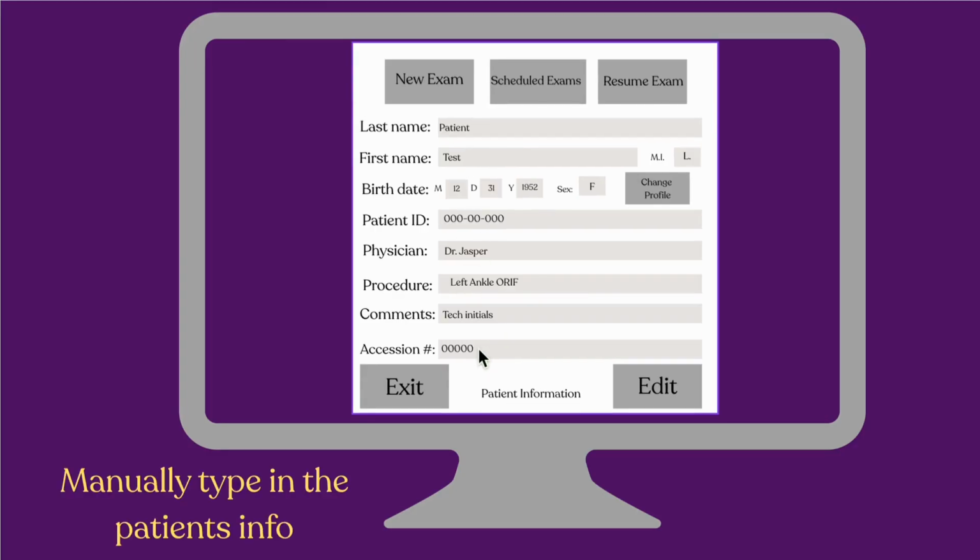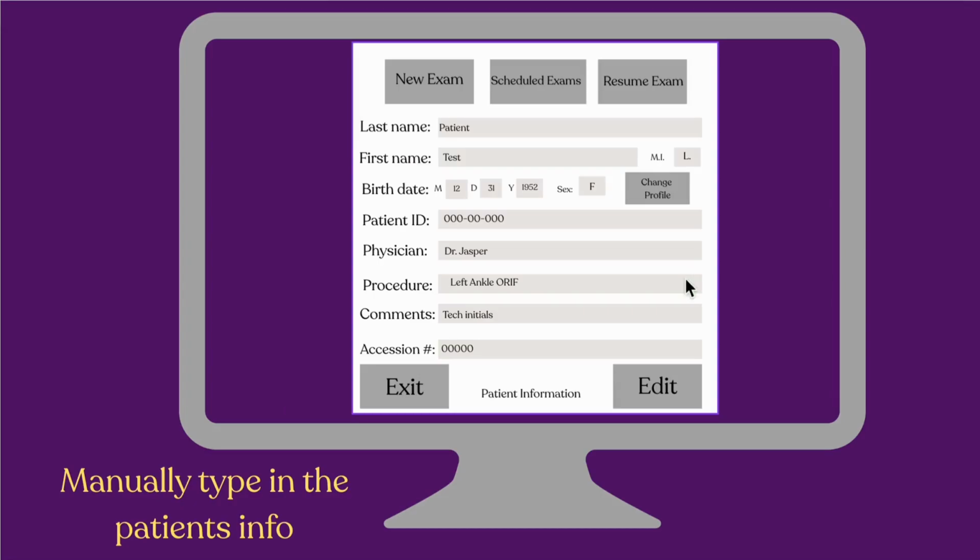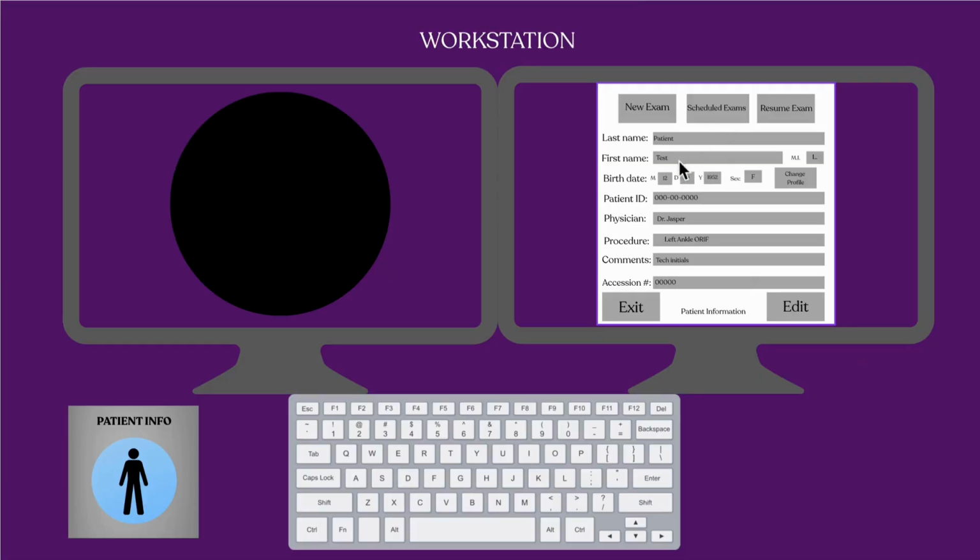that in here. All of the information that you typed, you can see here once you manually type that in. You're going to use the patient label, just double check, verify that you have all of that correct information here. Anytime you have the white boxes seen here, you can make changes to any of the information that you put in. However, when the boxes turn gray, you cannot make any edits or any changes to the information here.